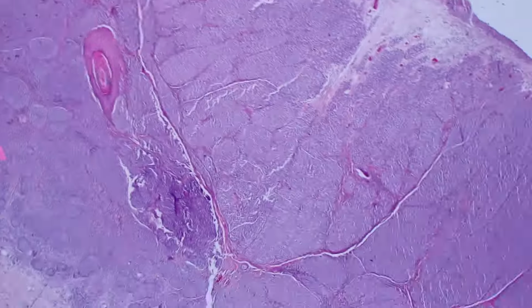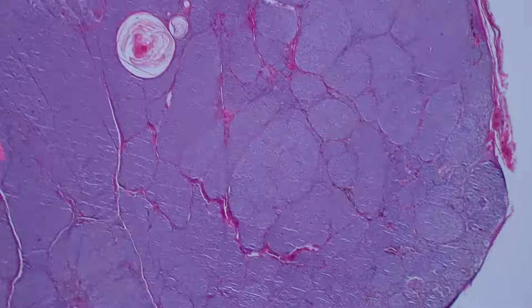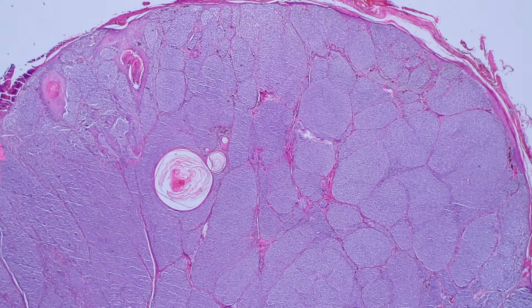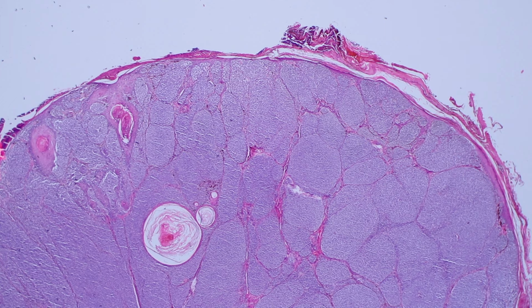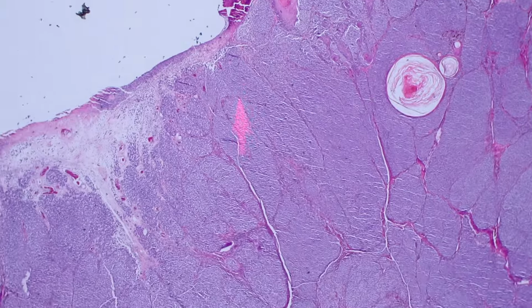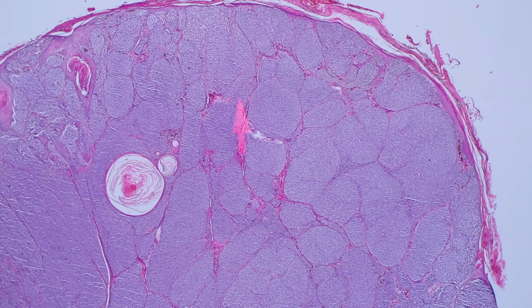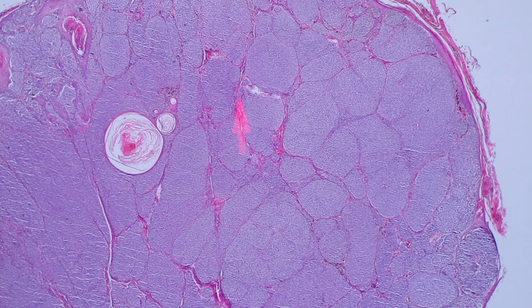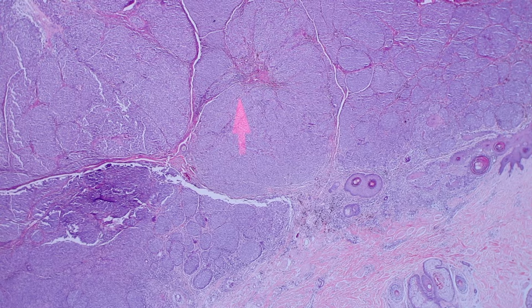And here's an example also of lack of maturation. Look at that. The whole dermis is filled with a uniform population of melanocytes. You don't even have to look at high power yet to see that you have huge, massive nests, and they're all packed really tightly together with very little intervening dermal collagen. The nests up here are big and large, and as you go down, there's still huge nests the whole lesion through. It's like an entire solid sheet-like packing of nests together. Each nest is kind of a sheet, and all of the nests are packed closely together. And at the top of the lesion superficially and the deepest aspect of the lesion, it looks almost identical.